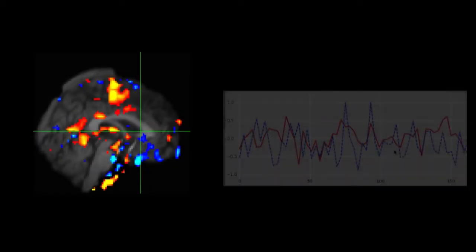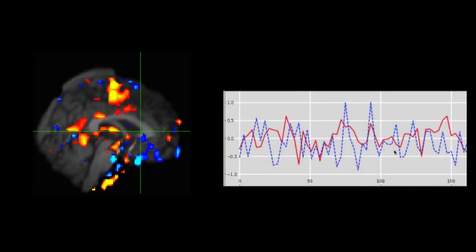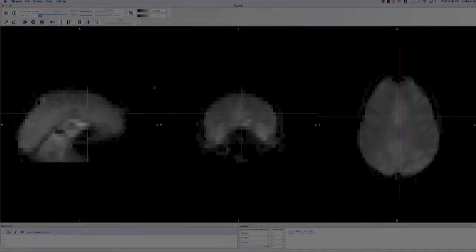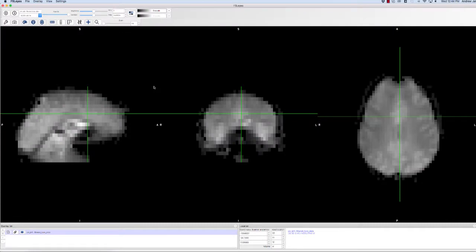So far we've used FSLeyes to look at spatial data, such as where activation maps onto the brain, and temporal data, such as the time courses of different voxels. FSLeyes is also an excellent tool for showing how your model is fitted to your data, and for helping you build your understanding of how beta weights are estimated.